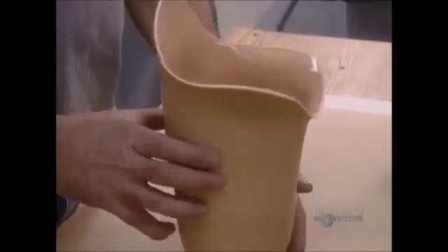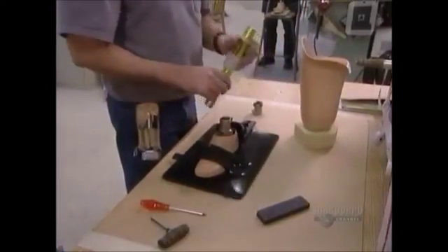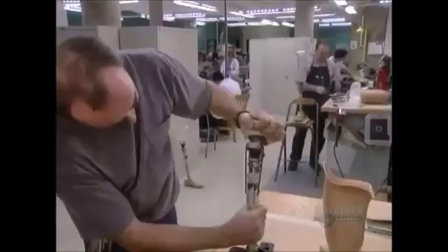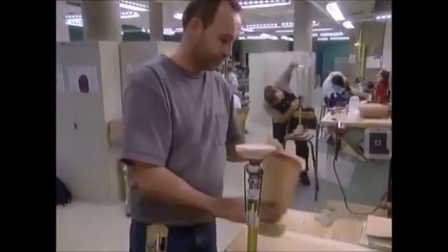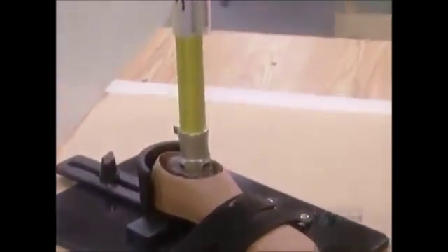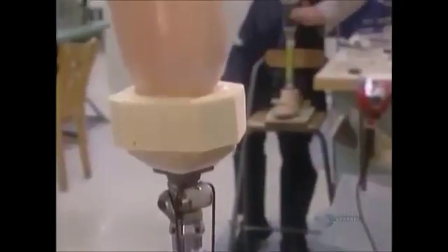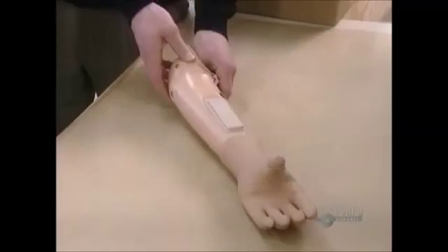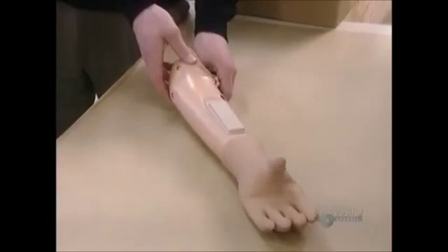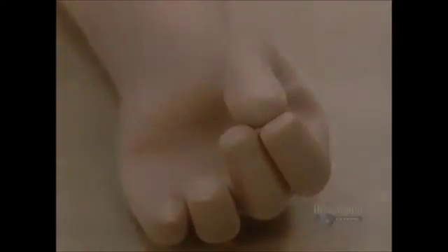The socket connects to another plastic shell containing the mechanics. Or, like this artificial leg, the mechanism can be modular and covered in just a skin-colored foam. If the muscle at the site of the amputation still emits a good electrical signal when contracted, the patient can get a myoelectric prosthesis. It has an electrode that captures and amplifies the signal, triggering the artificial hand to open and close.